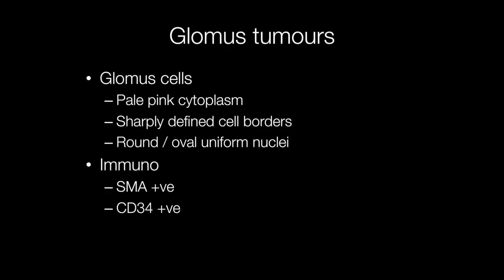Histologically, the glomus cells have pale pink cytoplasm, sharply defined cell borders, and round or oval uniform nuclei. Glomus tumour cells show positive staining for smooth muscle actin (SMA) and CD34.